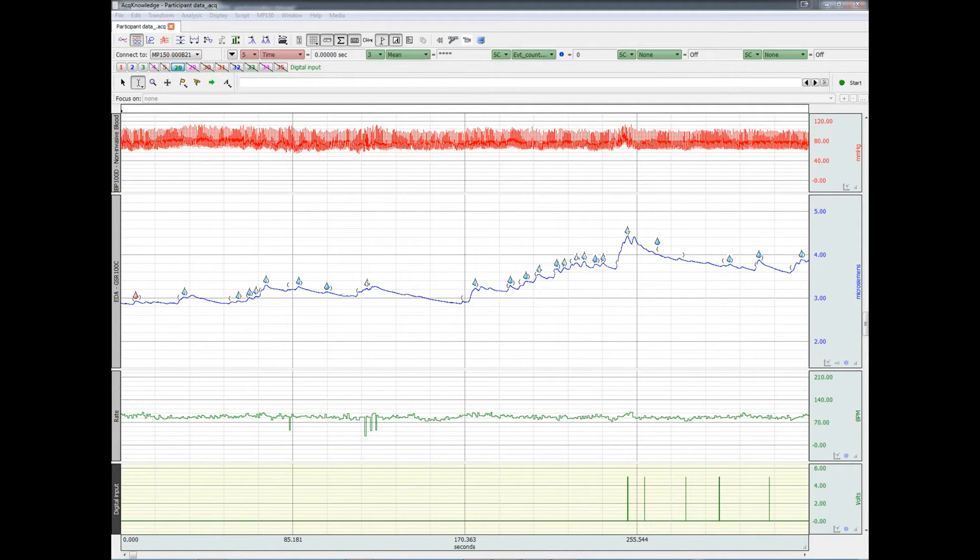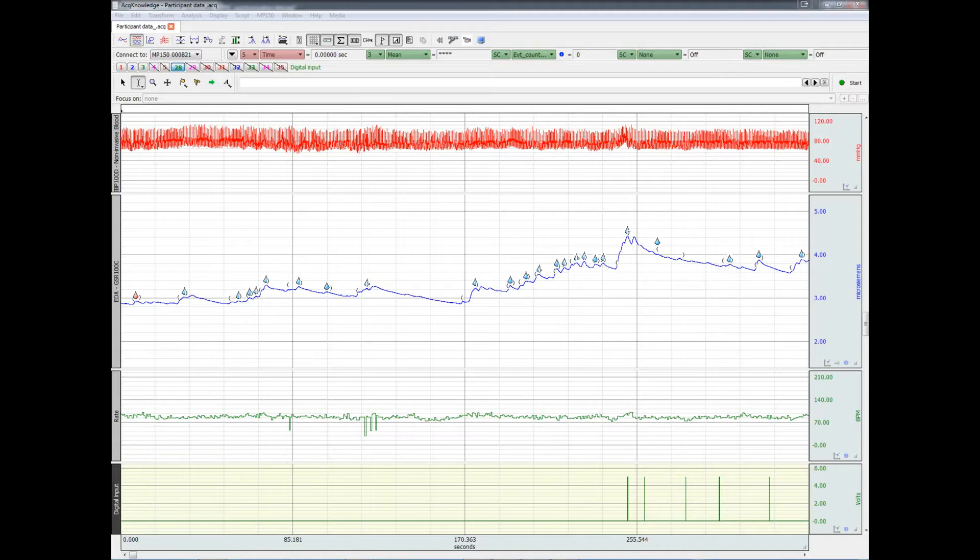Starting with version 4.3 of ACKNOWLEDGE, it's possible to synchronize and merge Biopac physiological data and SMI eye tracking data. The SMI computer parallel port should be connected to Biopac's STP100C.